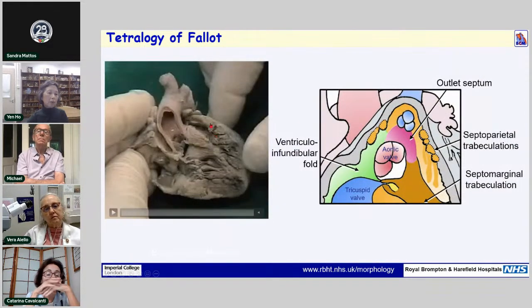This is like your subcostal kind of echocardiographic cut. You see the outlet septum, quite a long teardrop shape, isn't it? But the thing is, the long axis of this teardrop is pointing into the outflow tract, and that's the substrate for subpulmonary muscular obstruction. And over here, the aorta, aortic valve, and the ventricular septum, again, a perimembranous VSD.